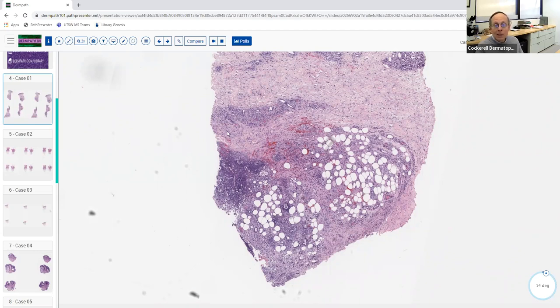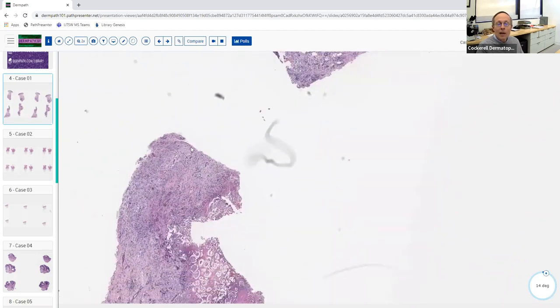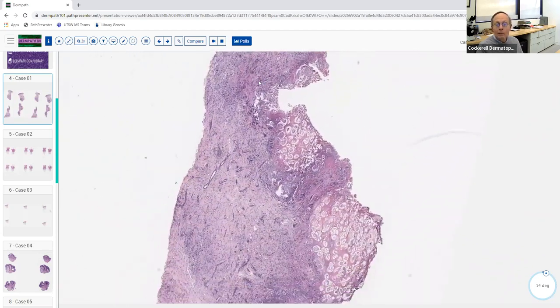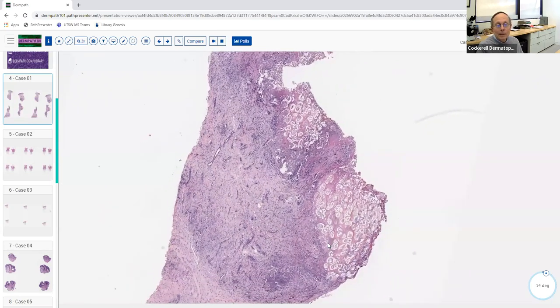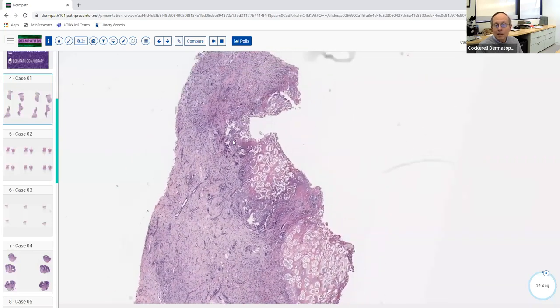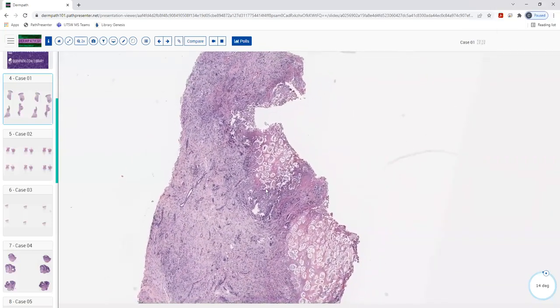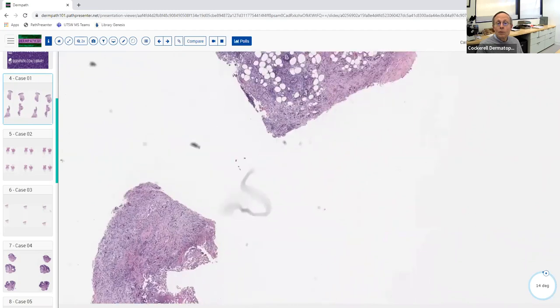When you see something like this, it's wiping out virtually the entire lobule. The septum is not thickened or anything — it just looks like there's a diffuse process involving the entire lobule. So I agree — this would be a nice example of a lobular panniculitis. Here's another piece; they may have taken a punch and then did a telescoping punch and got a second chunk in here. So — lobular. And then what's the next thing that you do when you've decided it's lobular? What's the next step?